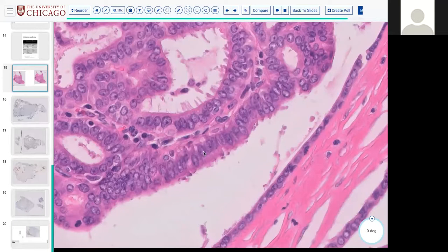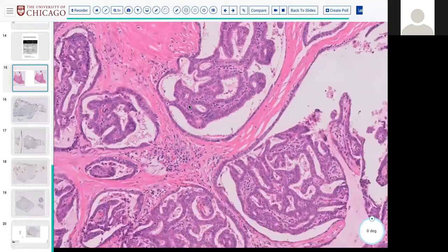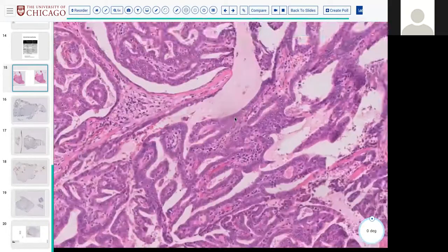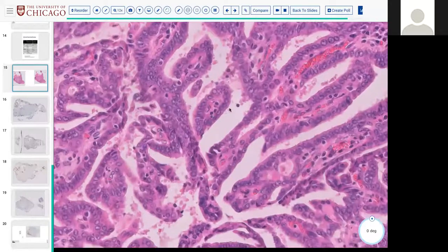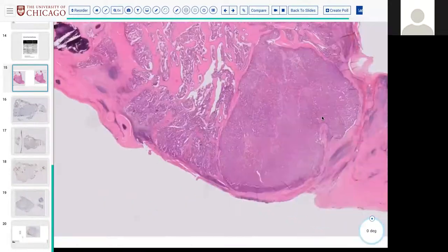Yes, or at least, yep, the nuclei are kind of oval. So, yep, you can keep talking. Do we have any history on this patient? There is a variant of PTC, as I remember, the columnar cell variant, that could look like something related to intestinal or bowel.